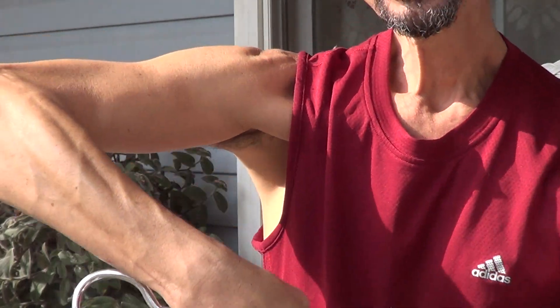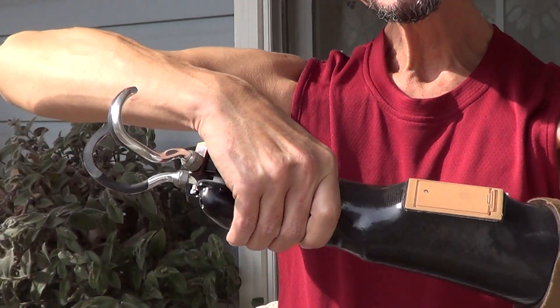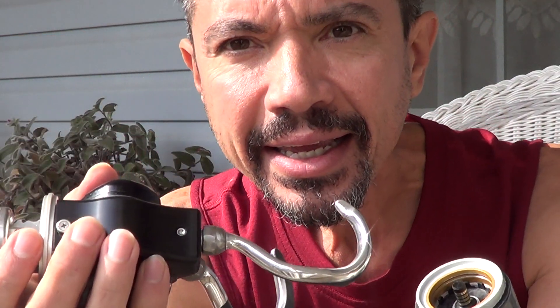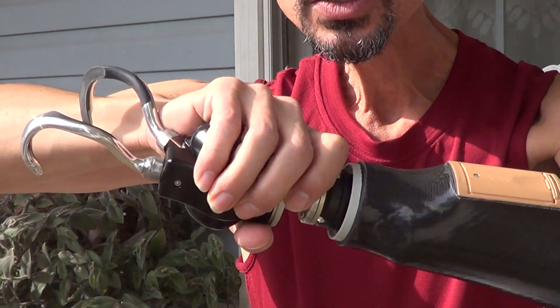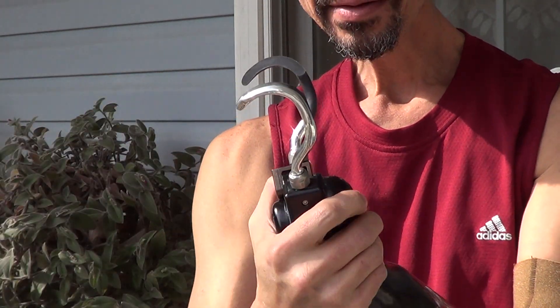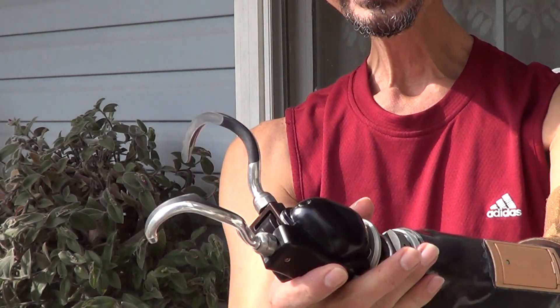Also, I can take this hand off — and I did, so you can just take it off just like this. I can put other hands on it that work with the same battery pack and sleeve. And it just goes back on — pop it, turn it a little bit — and I'm going again. I'm real happy with the prosthesis and this is it.